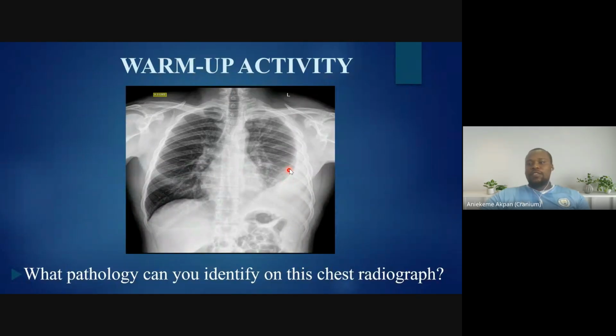This is quite important because, in fact, there was a time I was doing an echo with a cardiologist, and we were scanning the patients, and the cardiologist was like, "Why did you ask the woman why she came for the echo exam?" And she said that her X-ray report was cardiomegaly. And the cardiologist, after checking, the heart was normal actually. So when the man checked and checked, and there was nothing there, he was even forced to tell the patient, "Oh, bring the chest X-ray, the film that you did." So the woman brought the chest X-ray.